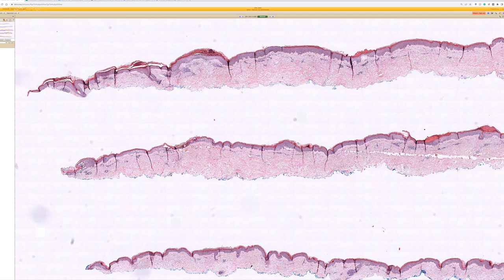It's unfortunately right under a fold in the tissue, which is maddening, but a great reminder of how focal scabies can be — the one area in one section out of this whole big strip. This is why clinically, if you think about scabies, please do a scraping with mineral oil or KOH. I like the mineral oil because you can see the mites swimming around still, which is delightful and disturbing at the same time. On biopsy, it's kind of a matter of getting lucky.